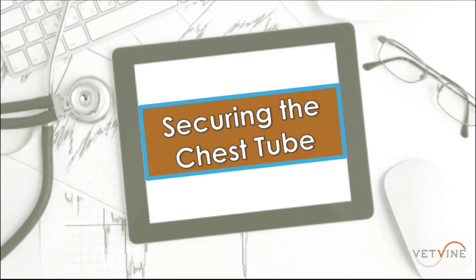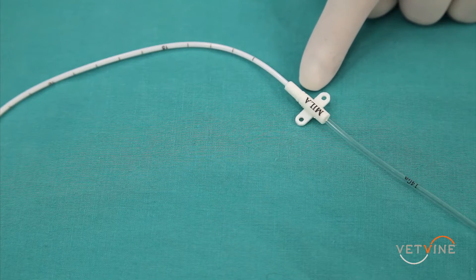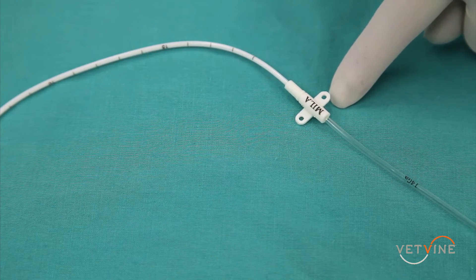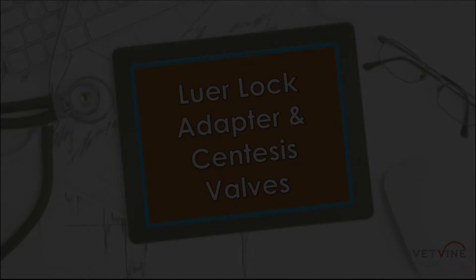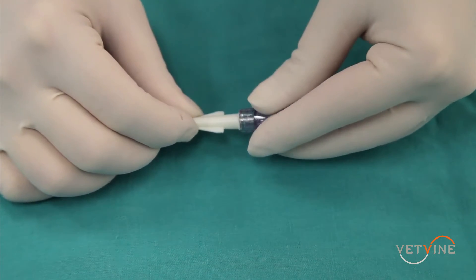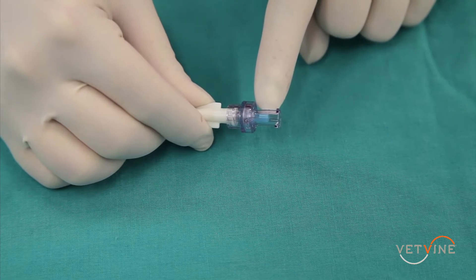Once the catheter is in place within the thorax, it can be secured to the skin using these grooves and suture. Additionally, loops of suture can be placed through the holes in the wings and then secured to the patient's skin. Once the tube is inserted into the thorax and the J wire is removed, either fluid will flow or you should immediately secure the luer lock adapter, which has a valve that prevents air from entering the thorax.